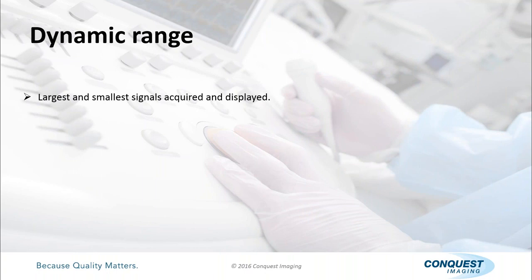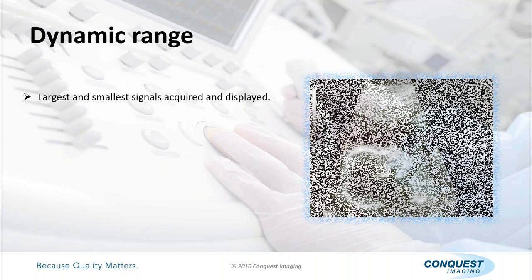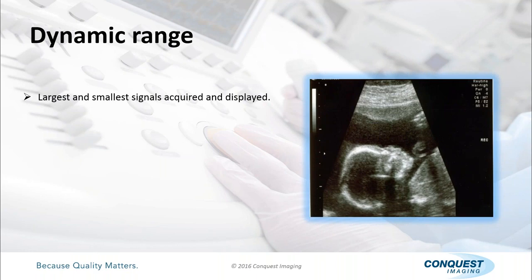Dynamic range, also known as contrast resolution. The largest and smallest signals acquired and displayed. And when you talk about that, you can see on the left-hand side of the image, there's a grayscale bar that goes from the darkest dark to the lightest light. So you have your darkest dark, and then in the image, that's what's represented.